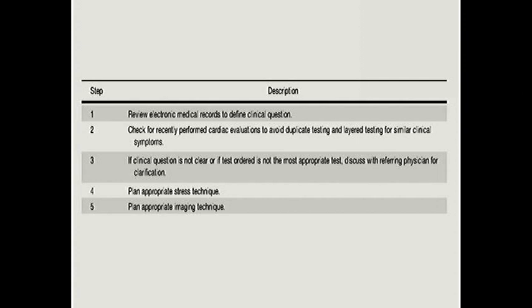Of course, we can't always do that. This would be the ideal situation. We are going to look at cases of patients afterwards because some patients would not benefit from a study. So why don't we just do a different thing? So actually we have to discuss the indication with the physician. We have to plan the technical protocol so that it's appropriate for that patient.